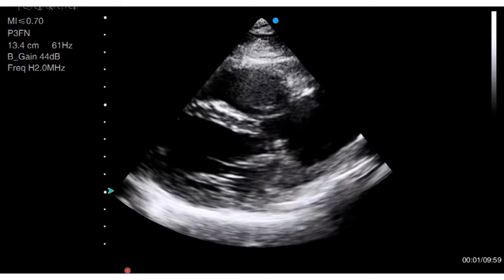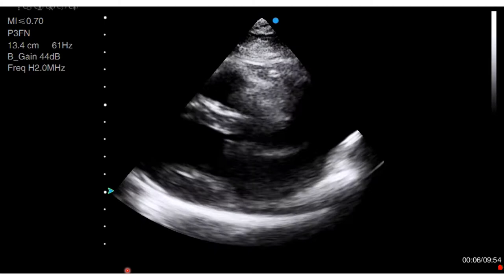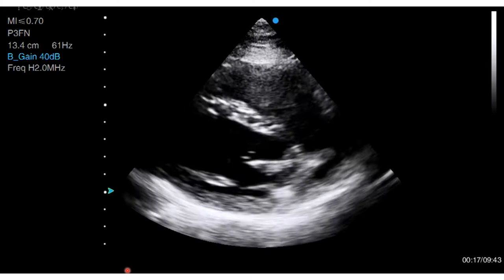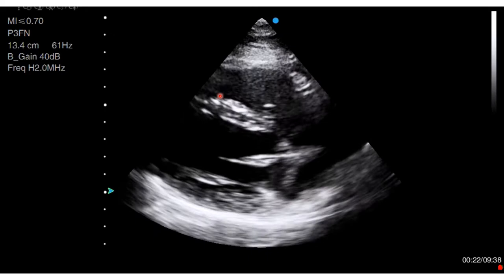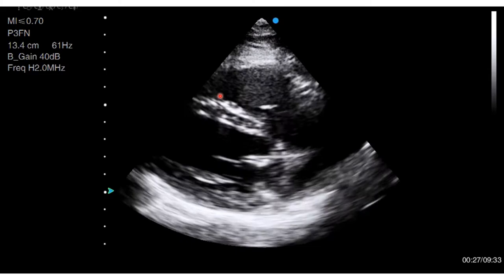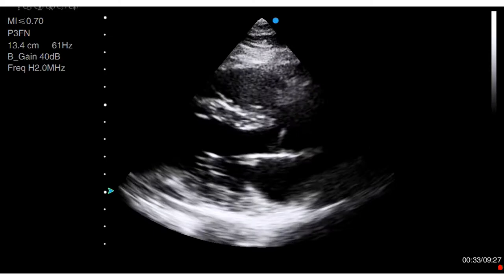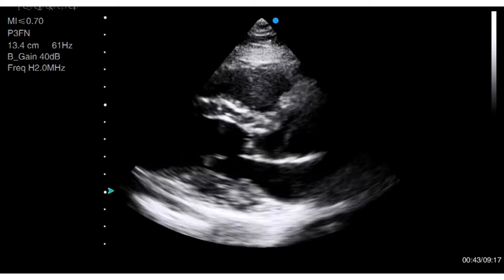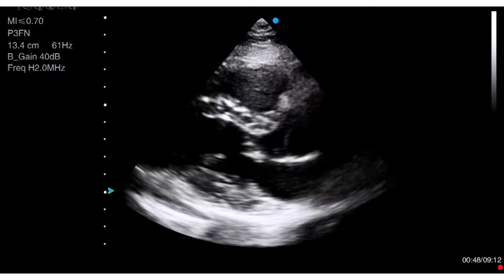This is the human heart, and you should be able to recognise all of the same features you've seen already. I'm scanning a little unconventionally here — I've twisted my probe to approximate the type of view you'll get in a dog or a cat. You won't see the right atrium as obviously here as if this were a dog, but you can see the right ventricle and hopefully appreciate that it is normal in size in relation to the left. You can see the interventricular septum and how the walls of the left ventricle all squeeze together nicely in systole. Now I'm going to twist my probe very slightly — a tiny, tiny movement, even more so on a small dog or a cat. Can you see how another valve now pops into view? This valve is the aortic valve. You can also obtain this from the left side of the animal and get a little bit more of the aorta itself in view.